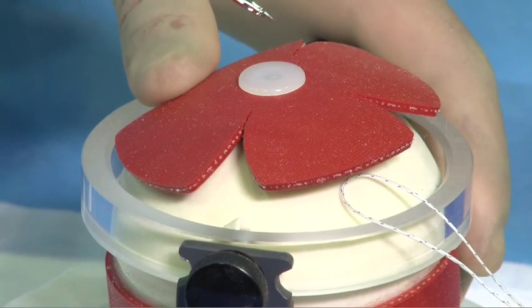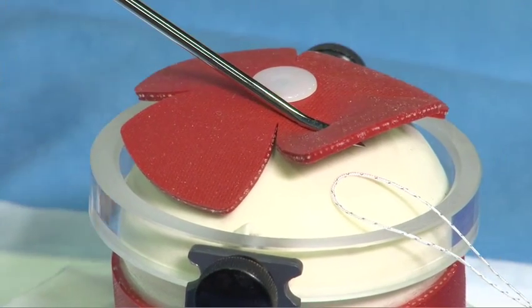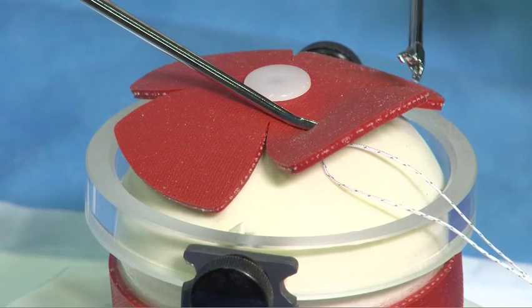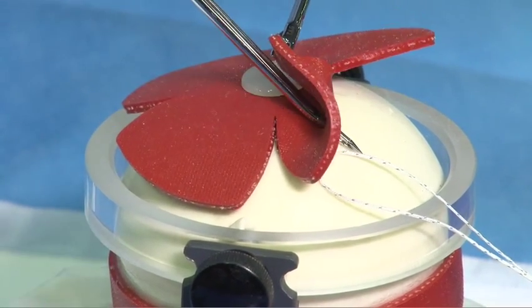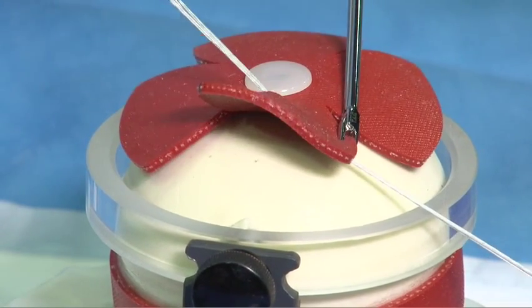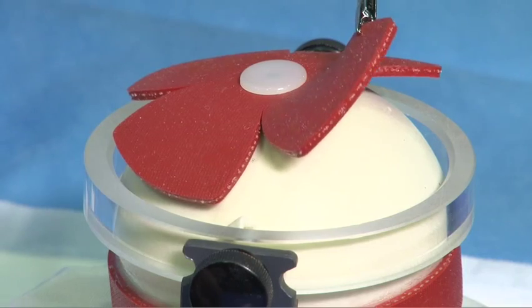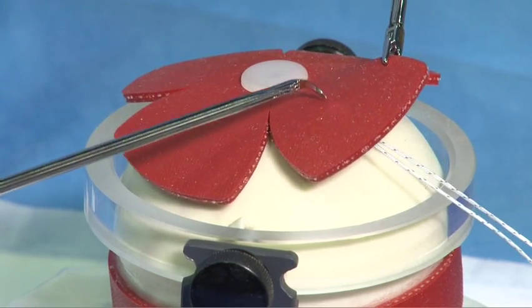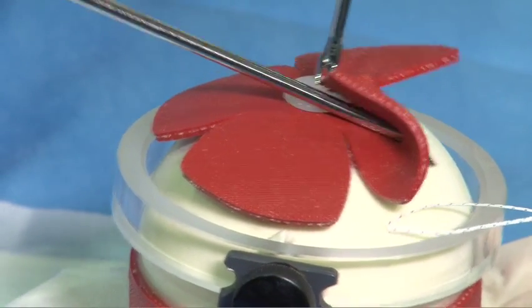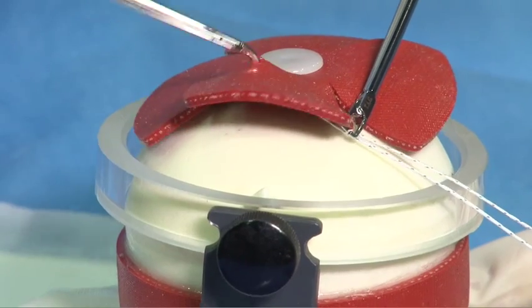As we penetrate through the rotator cuff itself, we want to use a slight twisting motion. Once we have penetrated through the rotator cuff, we can then either grasp the suture and control the position or fully retrieve the suture. The same passage can be performed with a clever hook device in a very elegant fashion, by following the curve of the rotator cuff, passing through the tissue itself, understanding the jaw has two positions, retrieving the suture, and delivering it back through the tissue.